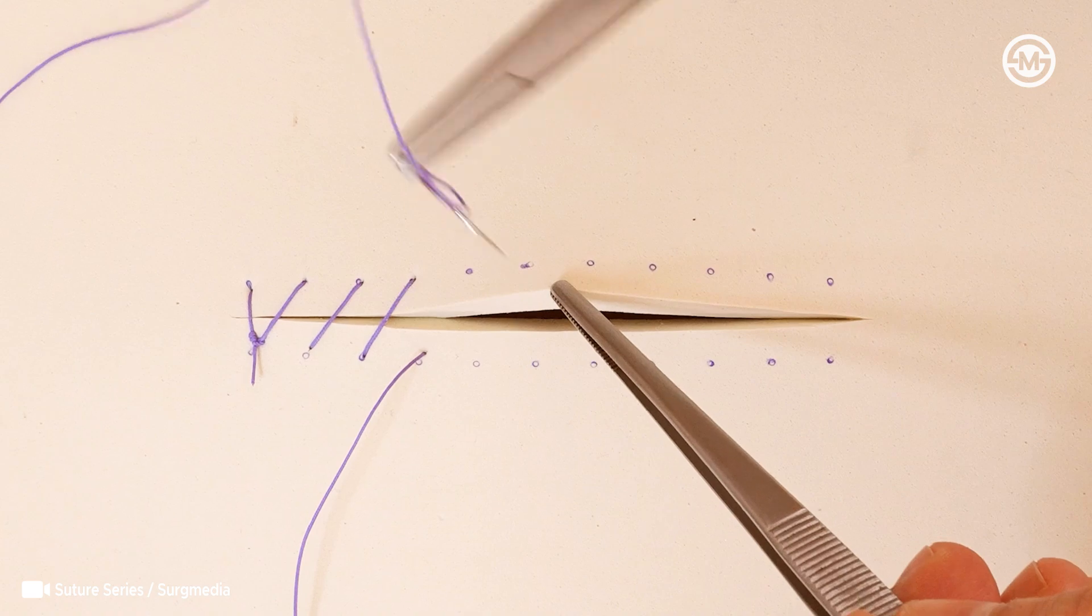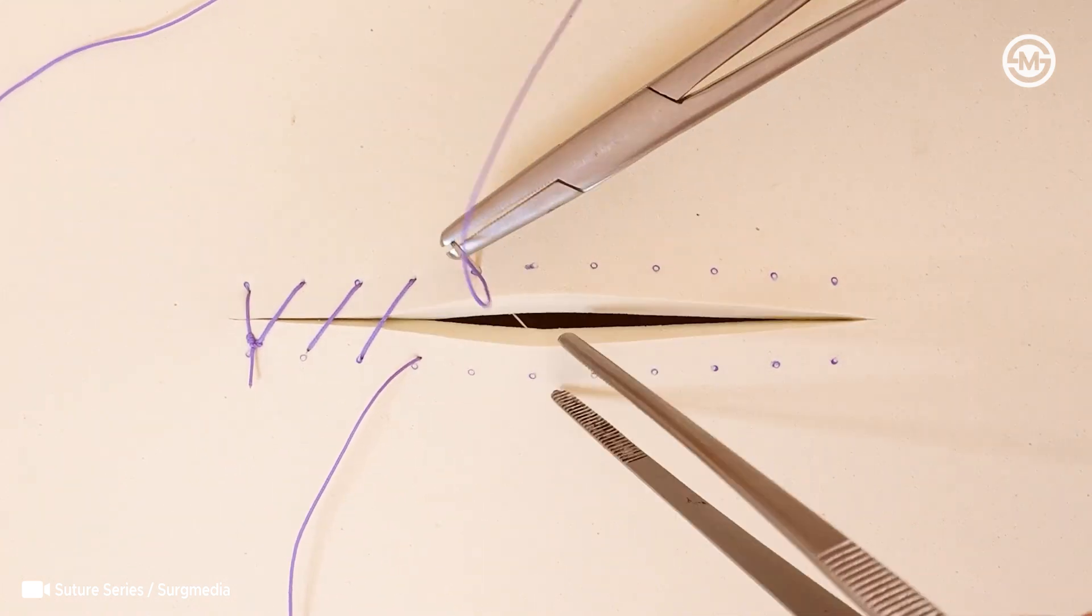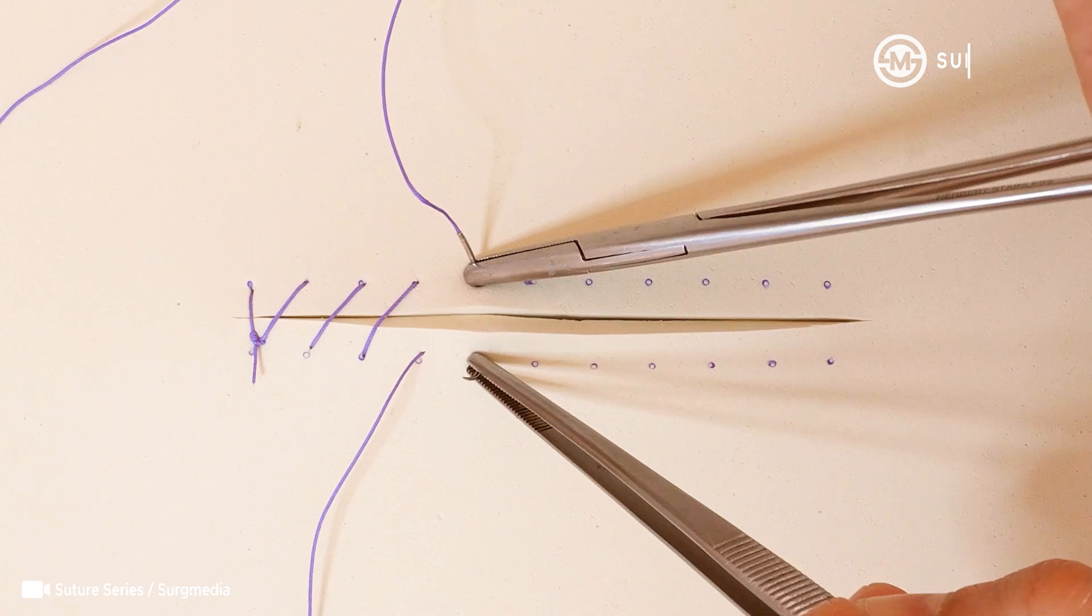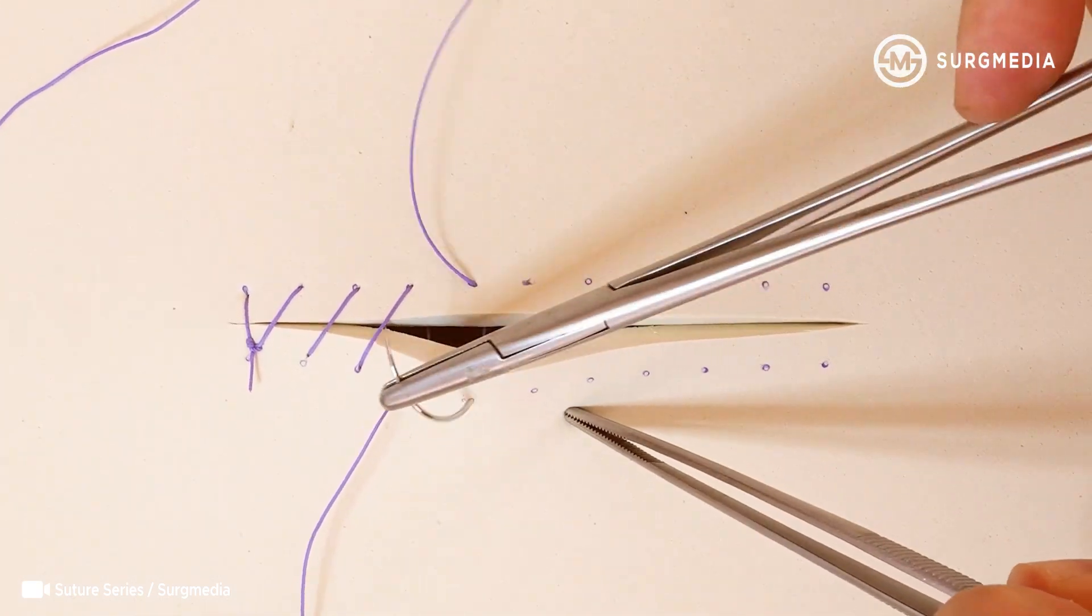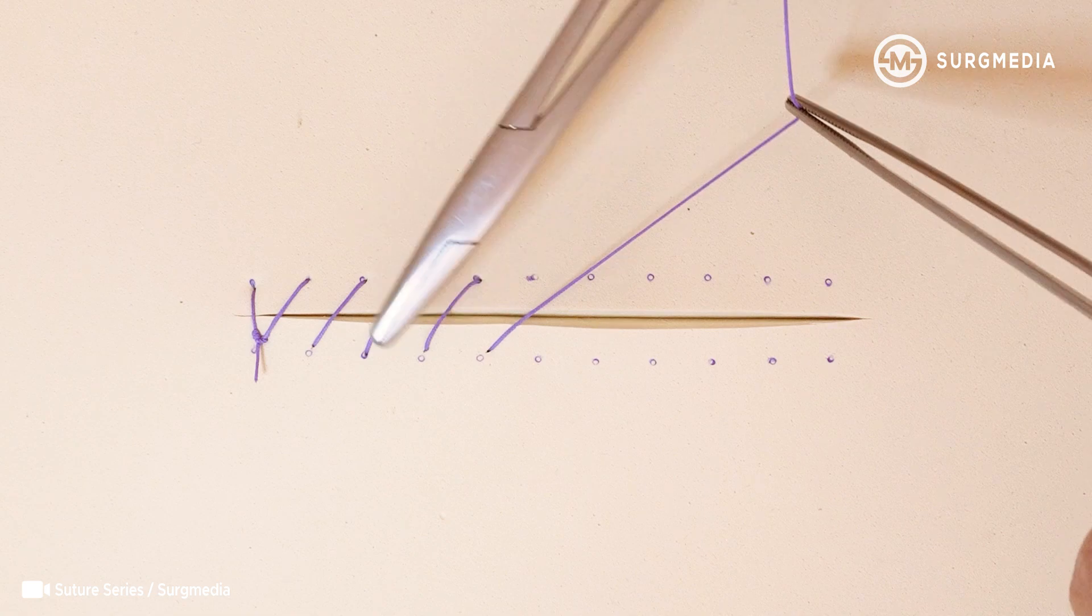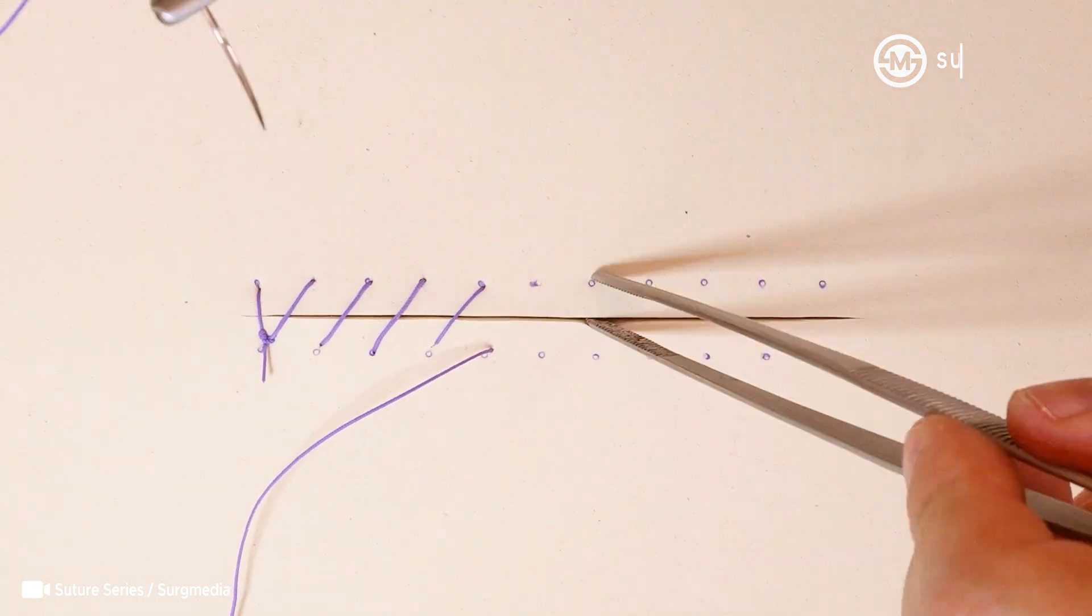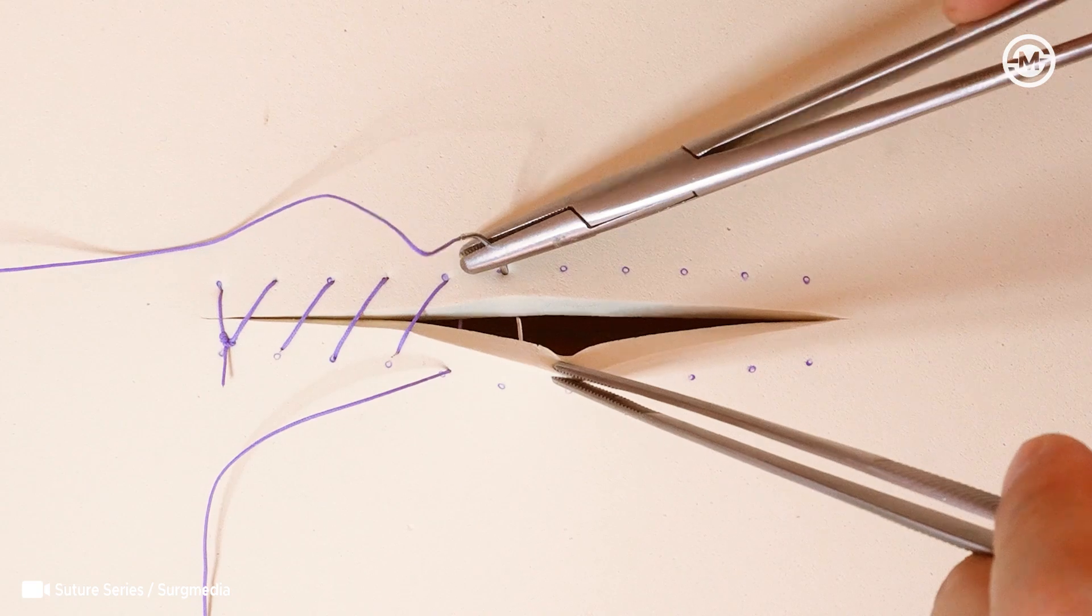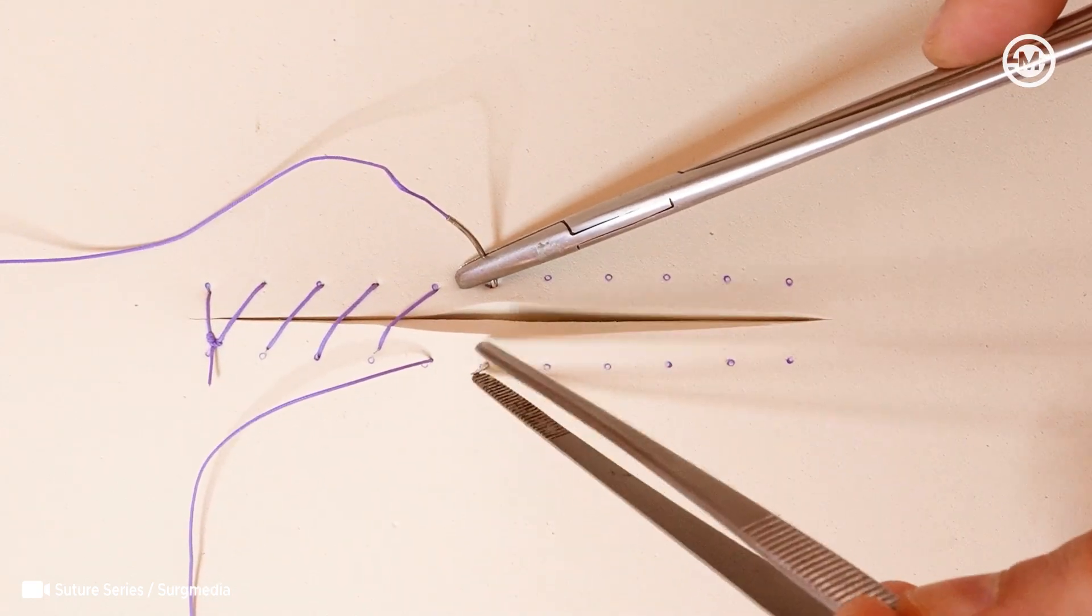Now let's talk about spacing, which is super important. In the short bite technique, you aim for 5mm depth and 5mm spacing between the stitches. In the long bite technique, it's more like 10mm deep and 10mm apart. The key is to keep things consistent. That helps with both tension and healing.